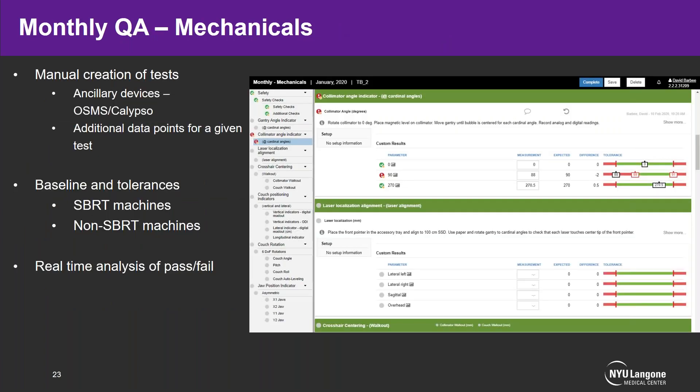Moving on briefly to mechanicals — this is what the mechanical QA pages look like when performing QA. Safety checks are incorporated, and all collimator, crosshair, gantry, couch rotations, and jaw tests are included. Baselines and tolerances can be defined depending on whether it's an SBRT or non-SBRT machine, and they provide real-time feedback showing whether measurements are passing, failing, or in the warning criteria.